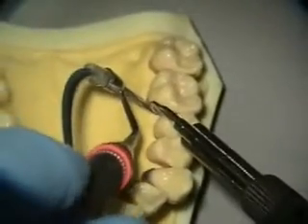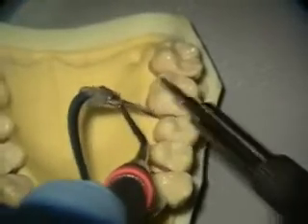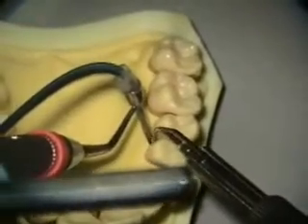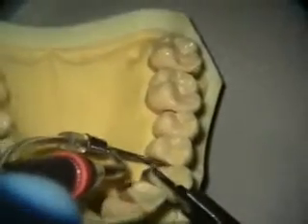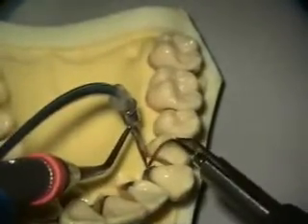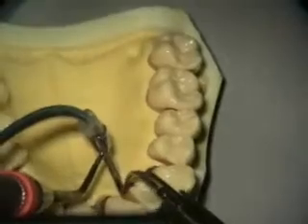Looking into the furcation — sometimes you have to really push into a deep furcation and twist the scope around, keep looking back and forth. Looking in the mouth and looking at the screen as you're feeling your way around, visually moving the camera using the screen to govern your movements. But you're still kind of using your feel too.